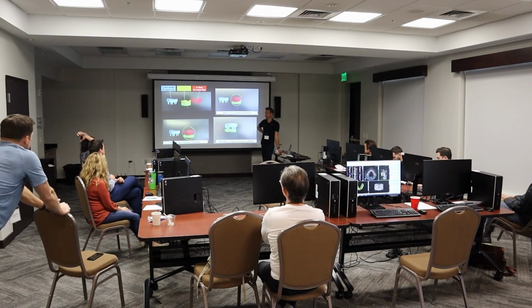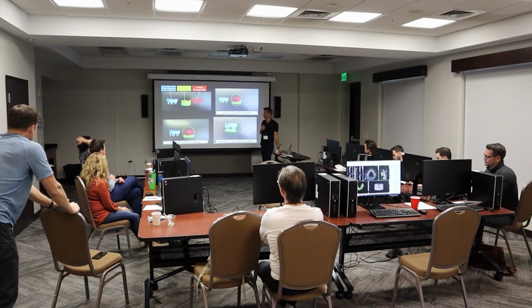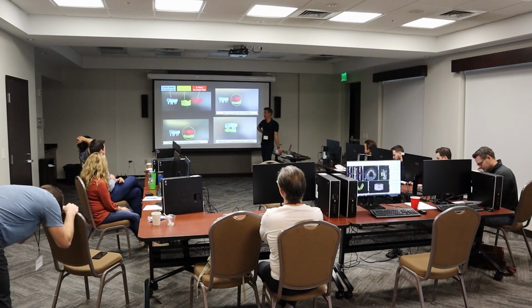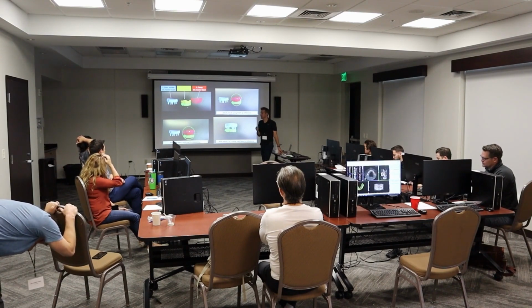Your original temp design is a Blue Sky Bio design, correct? Yeah, in this one it is. And so then you send the data to the lab. They're going to do now what, ExoCAD? Like mirror or kind of copy what you have already.